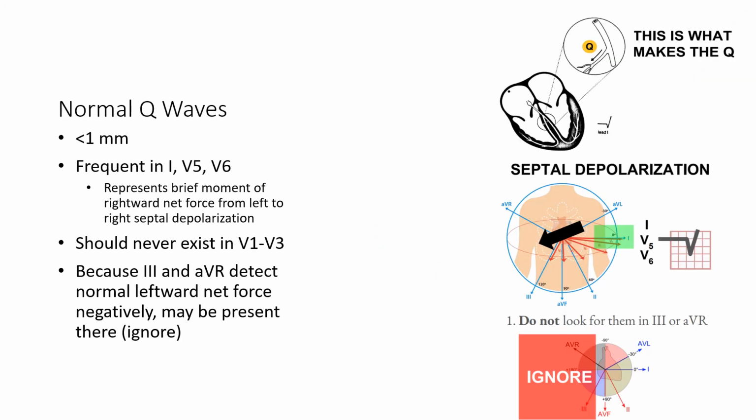Finally, we get to talk about the Q wave. You've heard about QRS complexes your whole life, yet half of the ECGs we looked at didn't have a Q wave. So why do we keep talking about it? Well, the Q wave normally represents septal depolarization, and it is present in some leads. Here we have the SA node. It would depolarize, go to the AV node, and then move down to the bundle of His and split off into the Purkinje fibers.